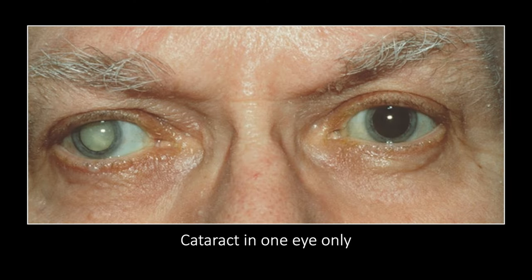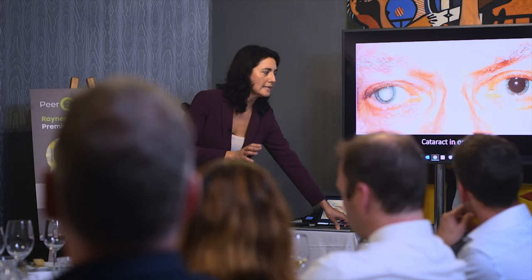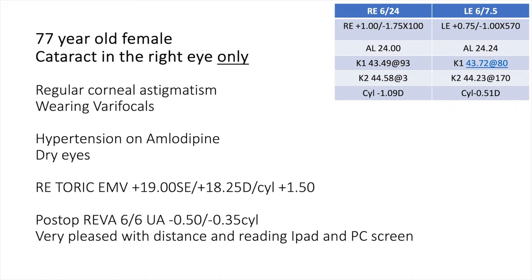Sometimes patients present with one cataract only and no significant refractive error in the other eye. For young patients in their 50s presenting with unilateral cataract — cortical or even white cataract — who are still working, driving, and using computers with expectations for perfect distance vision, we need to think carefully. If they are emmetropic in the good eye, an EMV lens may produce less imbalance than a trifocal, which can cause halos and glare in one eye. These lenses are optically excellent — very similar to a monofocal — so the glare and contrast match better between eyes.